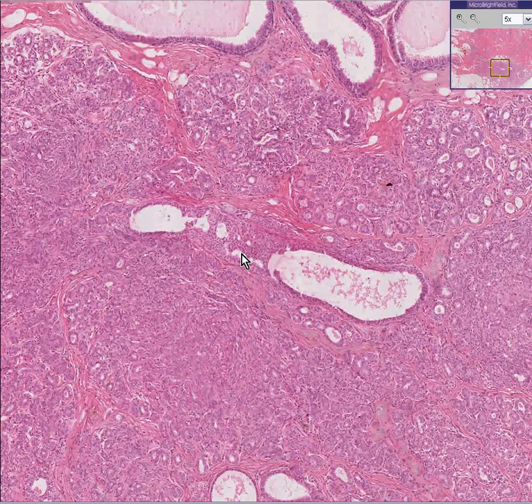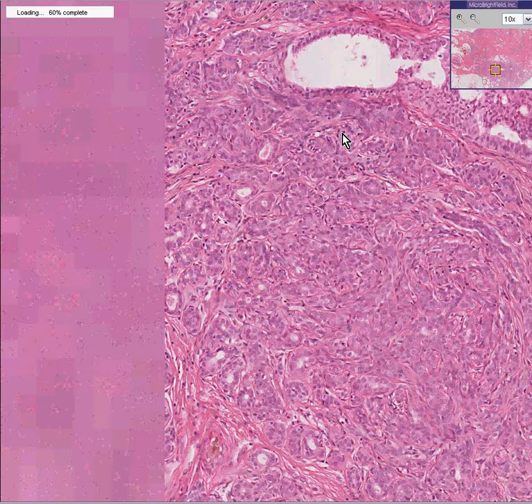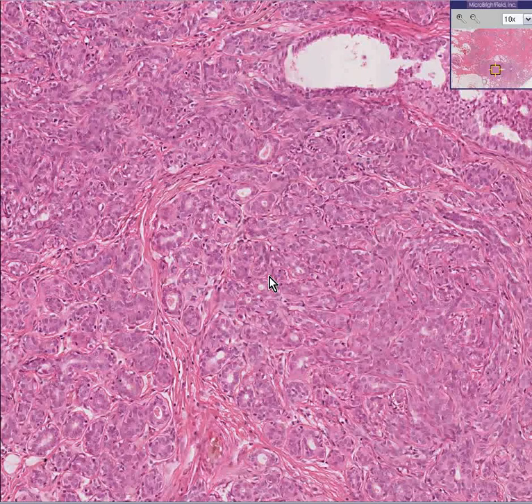If, on the other hand, lobules like you see here are hyperplastic, they could possibly give rise, under the same stimuli, whichever cause cancer, to atypical hyperplasia and then lobular carcinoma in situ, which may persist for many years, usually does, and could eventually infiltrate in the typical Indian file pattern of lobular carcinoma.